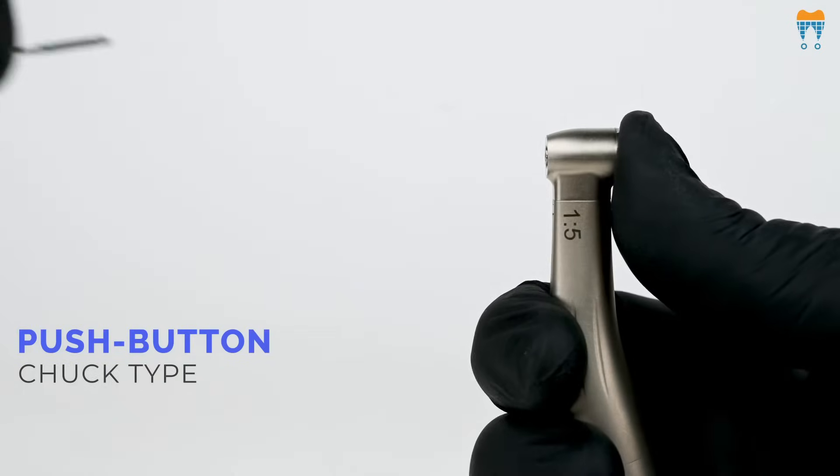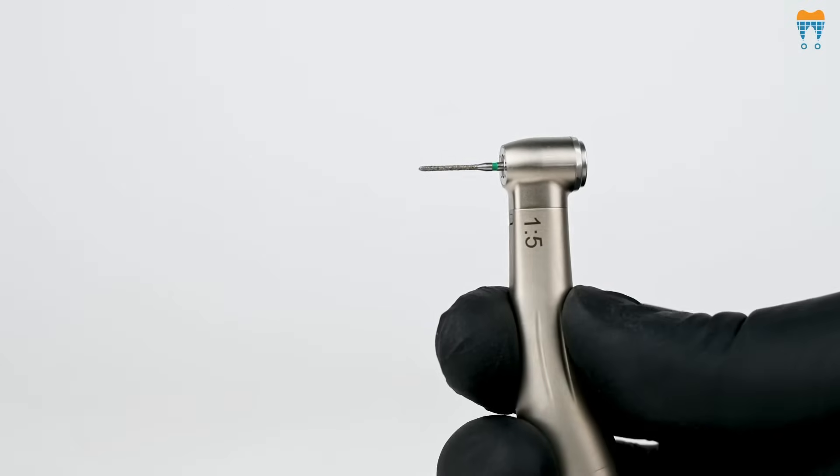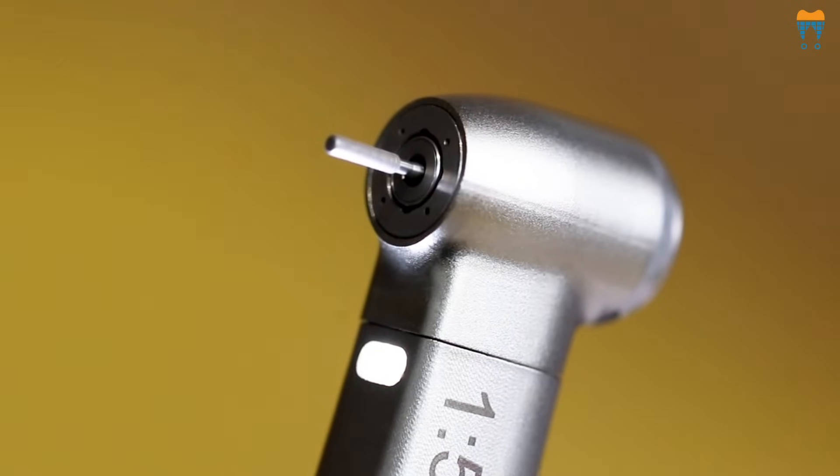Push-button chuck type allows for swift and effortless tool changes, streamlining the workflow.